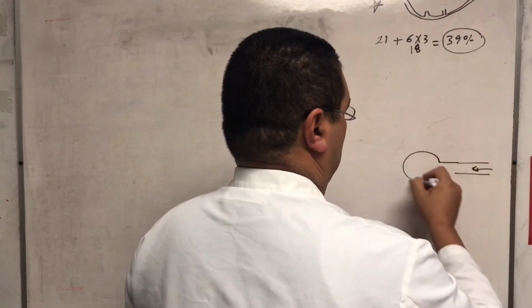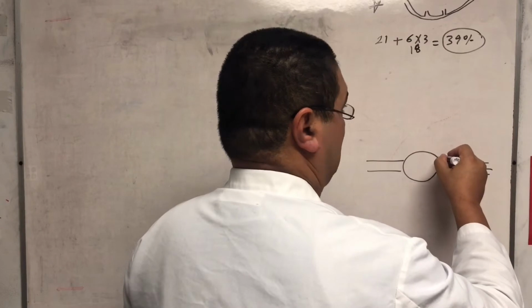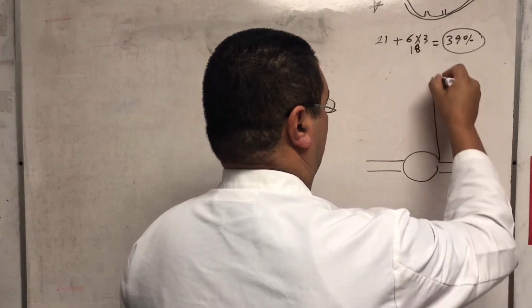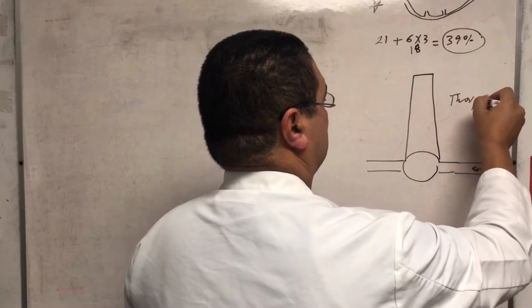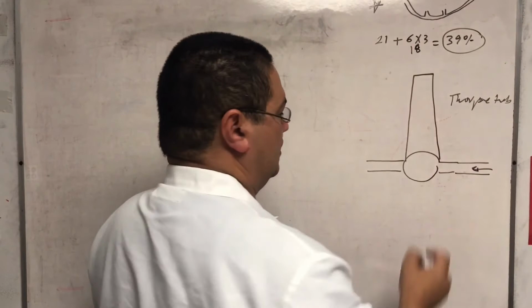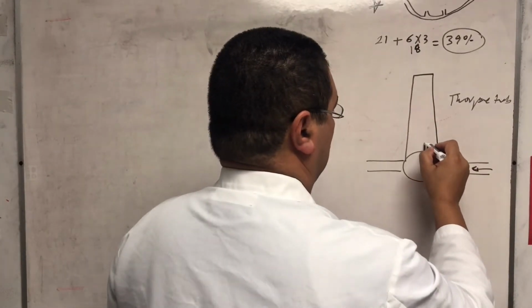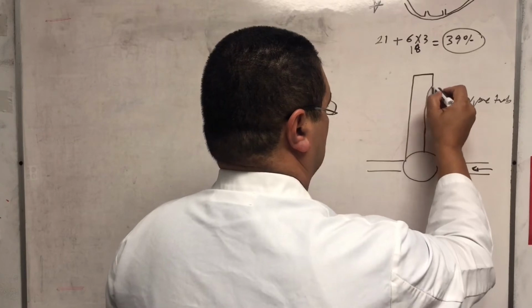It goes through this knob that you turn oxygen on, and it goes through something called the Thorpe Tube. The Thorpe Tube is the tube that we are using to measure, the flow meter, basically. Inside the flow meter is the Thorpe Tube, which looks like this.